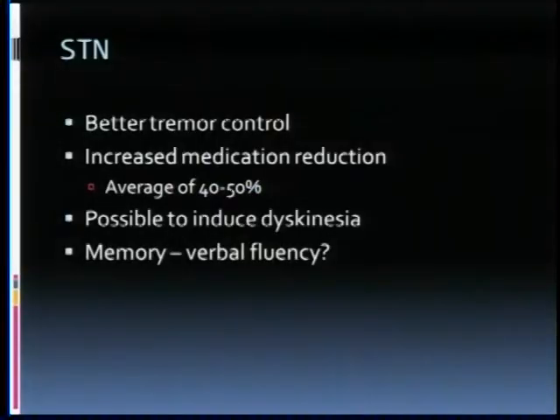But it can allow people kind of an improved on state, and it can easily tell us if we're in the right area programming. It's a real positive if people get dyskinetic with programming, that we're right in the right spot.